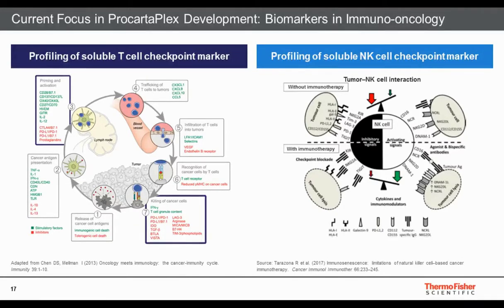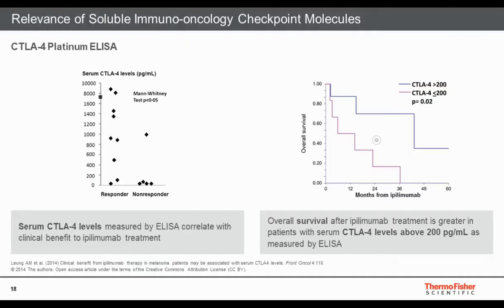For us and for the development of such immunoassays, it is important to say that soluble isoforms or shed variants of these molecules are described for a majority of these checkpoint molecules, and that these soluble forms are not just cell debris, but functions for these forms could be proven. So they are functioning either as immune adjuvants or decoy receptors, and thus are regulating these checkpoint pathways. This might, of course, influence the clinical efficacy of the individual checkpoint modulator drugs.